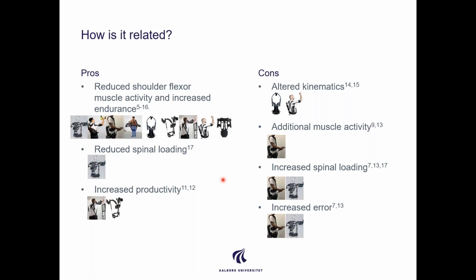But one way we can actually address this issue is by using musculoskeletal models, because then we can simulate a variety of interactions with an exoskeleton. And that was also the motivation for what we did in this study. We wanted to take out a specific exoskeleton and try to look in depth of how we can understand the interaction for the exoskeleton and the human body.